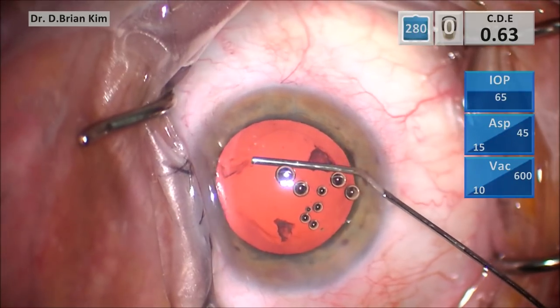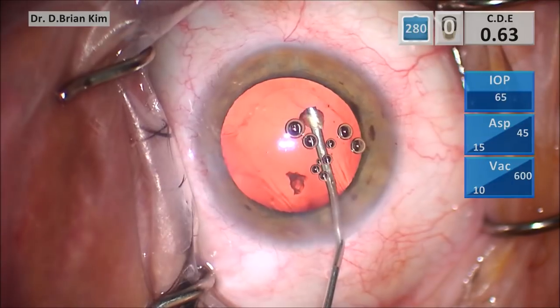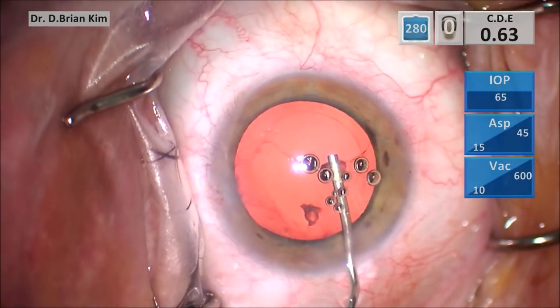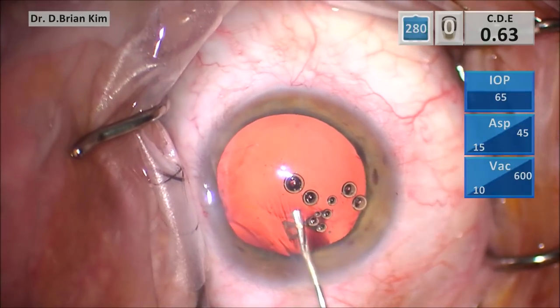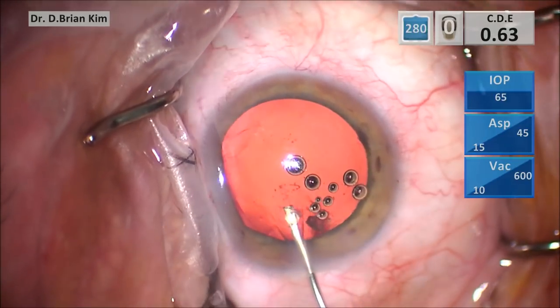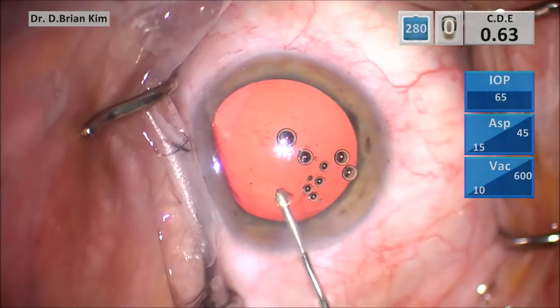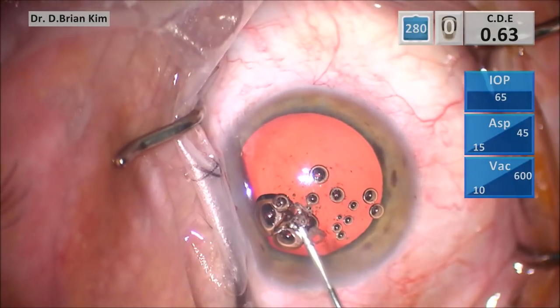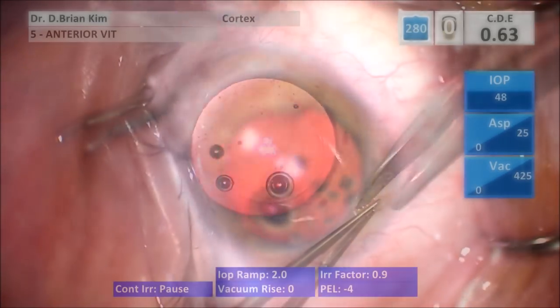I'm using a dry aspiration technique to remove that last remnant of cortex, which is a really neat technique, just using a BSS cannula and just pulling back on the plunger to do a dry aspiration of the cortical material. Now I'm using dispersive viscoelastic to just push those little small fragments towards the main incision so I can burp it out of the eye. So I feel like I have a fairly clean eye now.